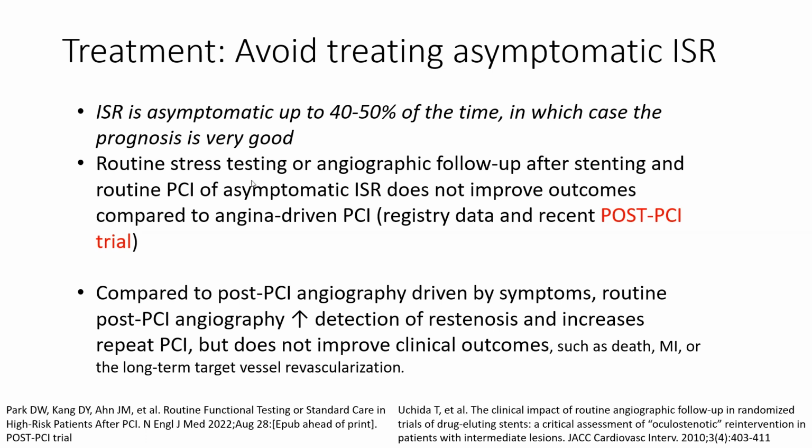Routine stress testing or routine angiographic follow-up after stenting to try to find that asymptomatic in-stent restenosis and to do routine PCI of asymptomatic in-stent restenosis has not improved outcomes compared to angina-driven PCI. This is based on registry data and, most importantly, the POST-PCI trial, a Korean trial published in the New England Journal of Medicine this year, 2022.